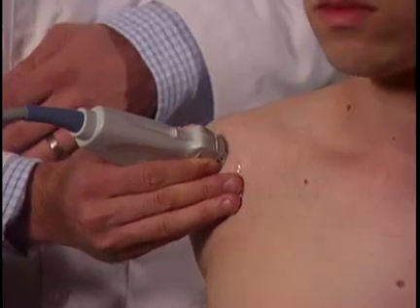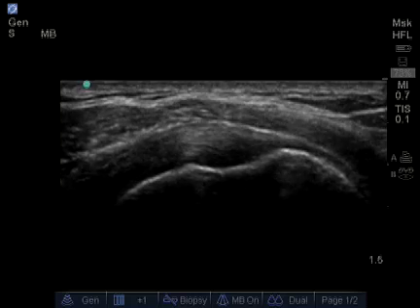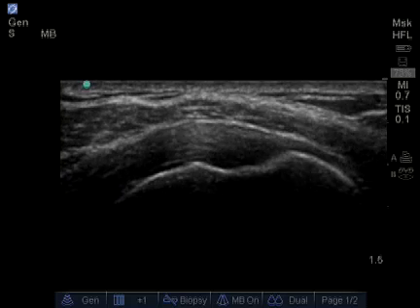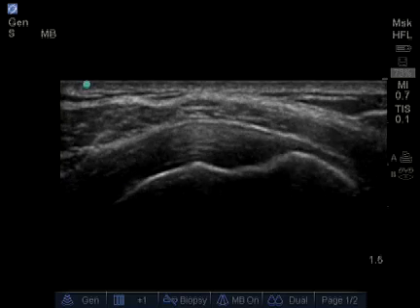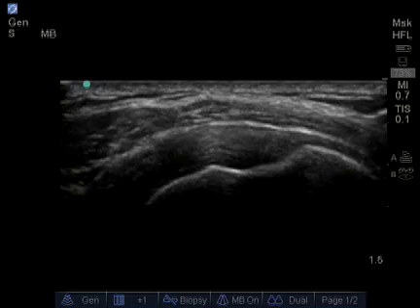What we're going to do is follow the length of the tendon on one end where it attaches at the bird beak, as well as through the opposite end, looking at the fibers and continuity to see if there's any abnormalities.